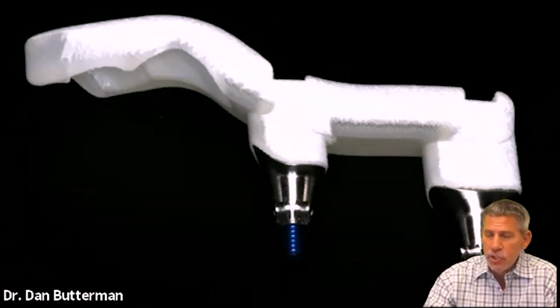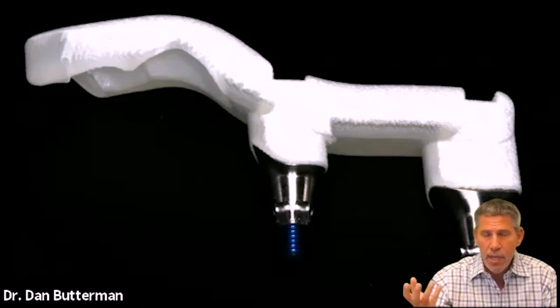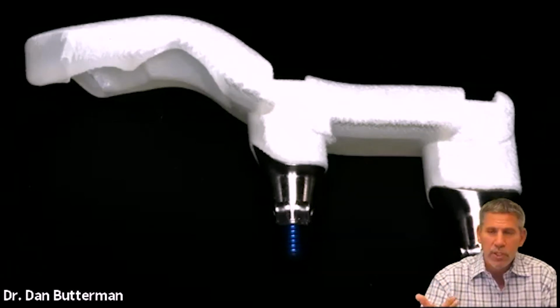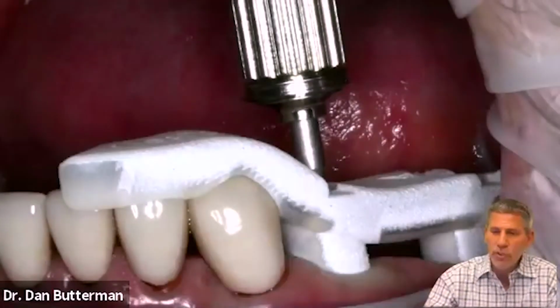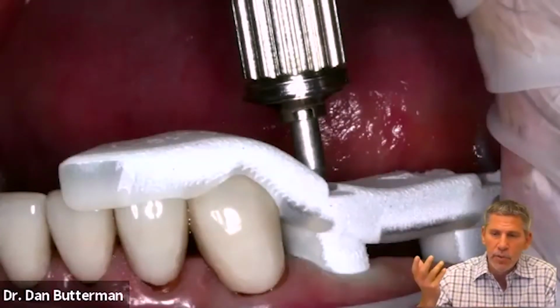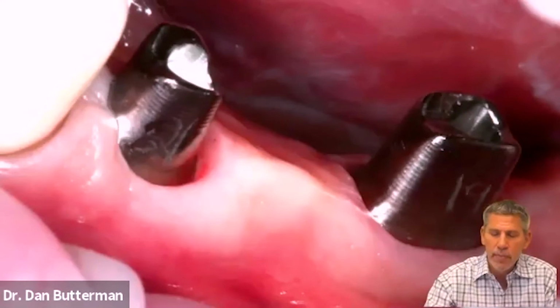This is just an insertion guide, so it allows me to take those abutments, and that's one of the things with multi-units, right, is you get one abutment in the right orientation and the bridge isn't going down, and you're not sure if you got the rest of the abutments lined up in the right position. This insertion guide is super cool because the way it works is it only goes in one way. The abutments go into the insertion guide that goes into the mouth, and then you torque these in so that you end up with things in the right position.